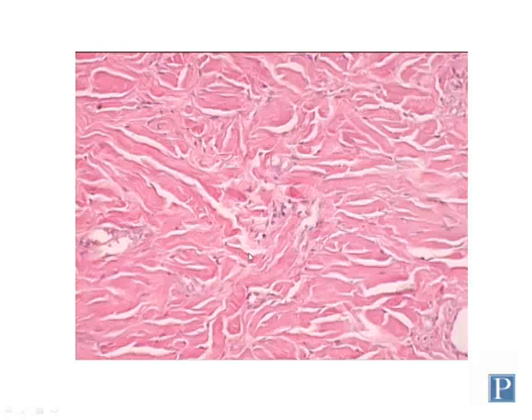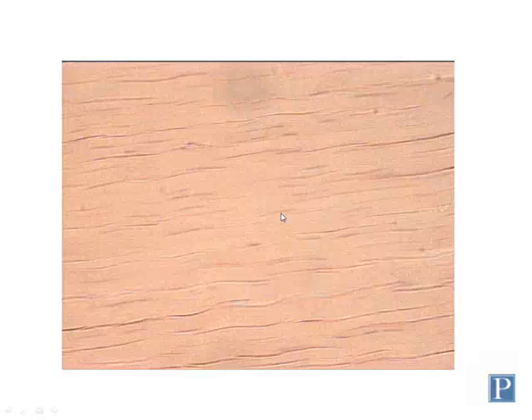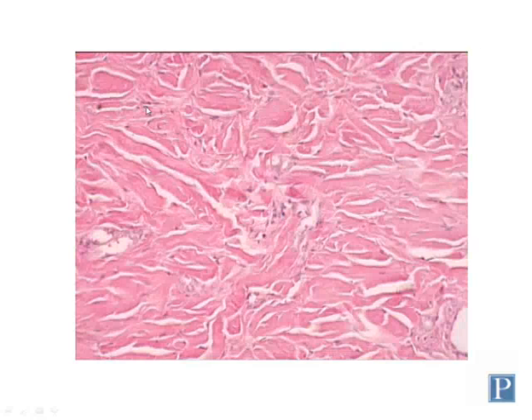So it's suitable for places like skin that are going to be pushed and pulled from multiple directions to help keep everything together. You can see nuclei of various cells. Again, most of these are going to be fibroblasts. So these small basophilic structures here, those are the nuclei of mostly fibroblasts.